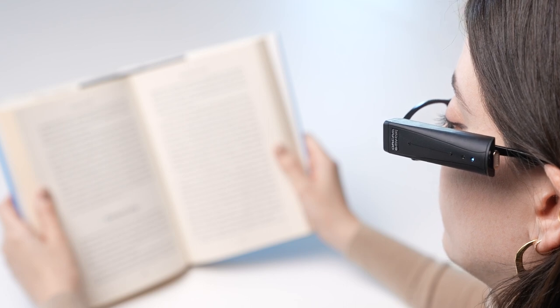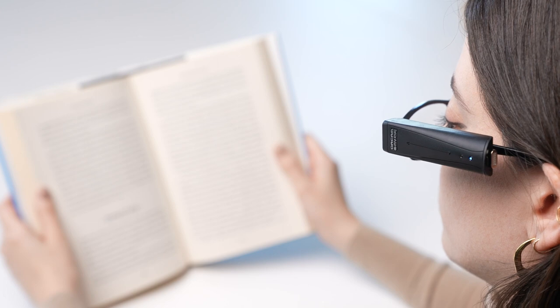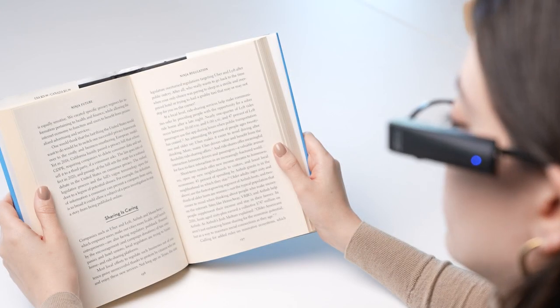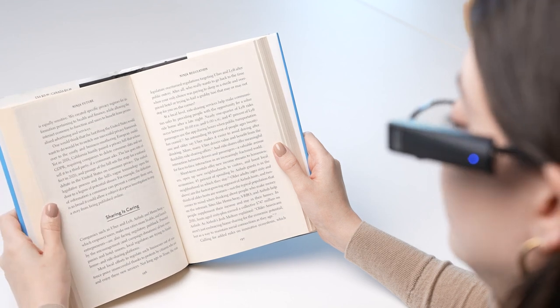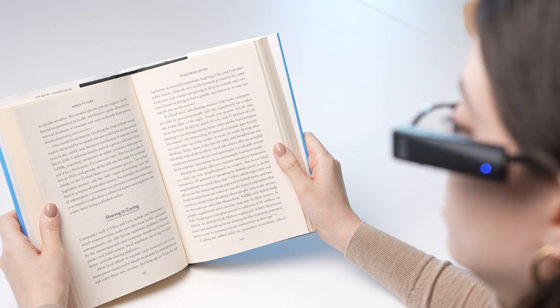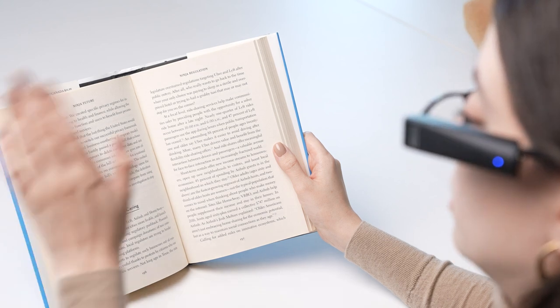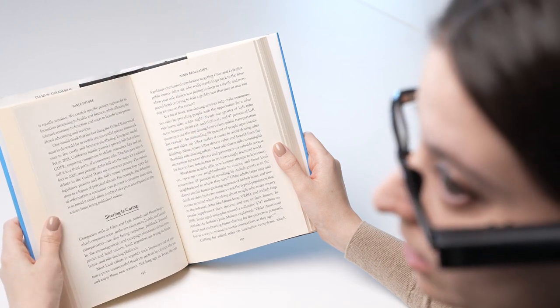from it. To read an amount written, say, "Hey OrCam, find amount," and it will tell you the amount, for instance, in an online store. You can also find a specific word in a block of text and have the device start reading from it. This enables you to navigate through the text or pinpoint specific words or pieces of information, such as dates or amounts, and then have them read to you.